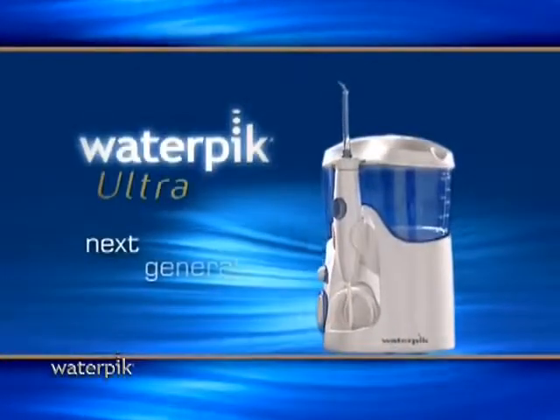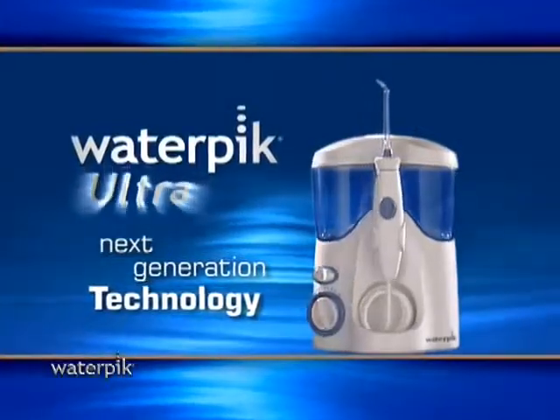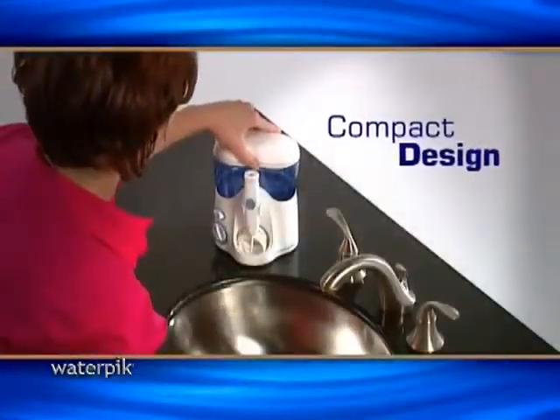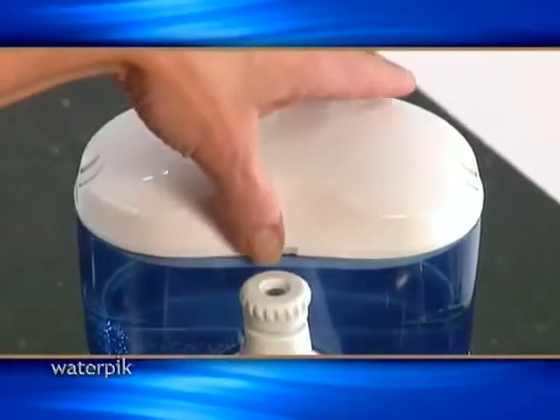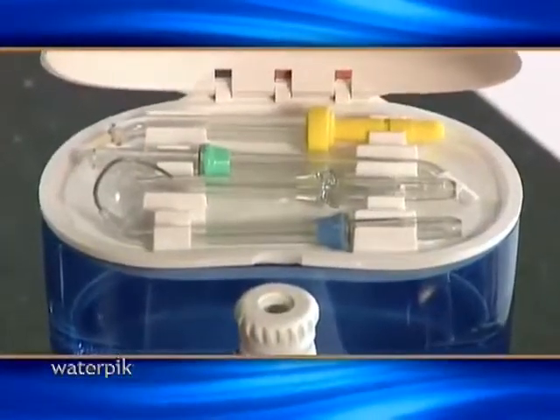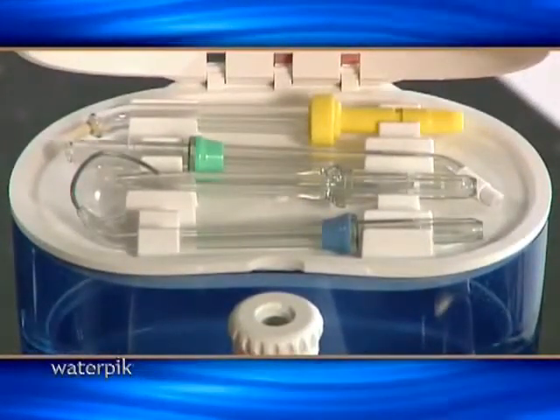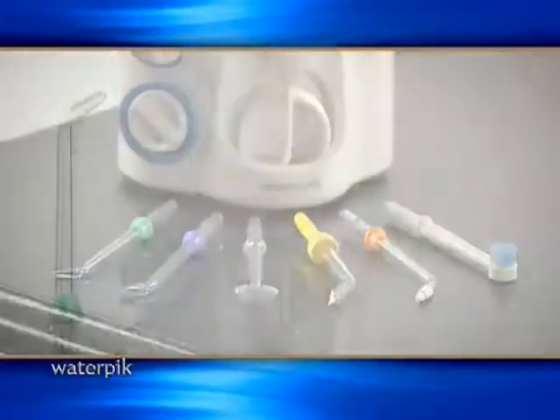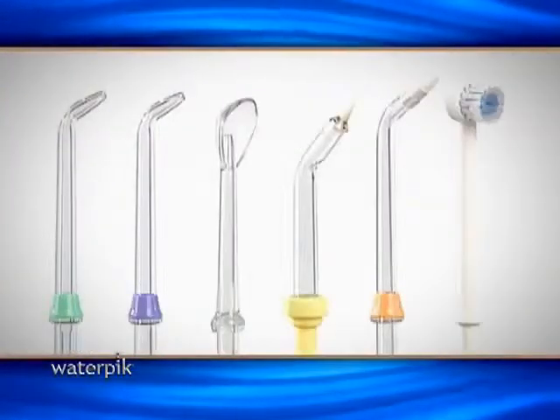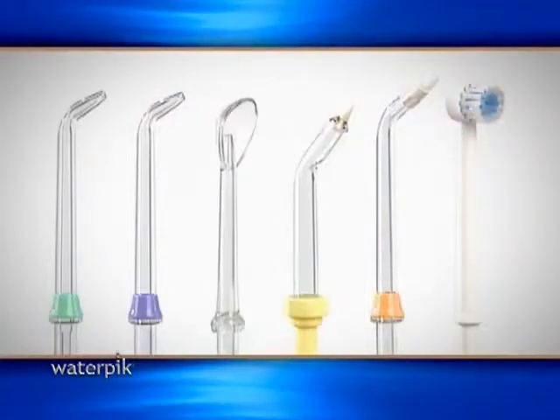The standard in water jet technology is the Waterpik Ultra with a contemporary compact design. Ten pressure settings to meet your individual needs, and a reservoir lid with tip storage to keep the reservoir clean and to neatly stow away extra tips. In total, the Waterpik Ultra has six attachments including the new toothbrush tip that allows you to brush and Waterpik simultaneously.